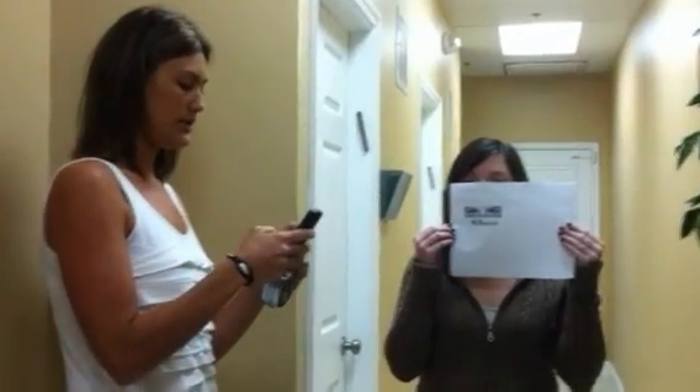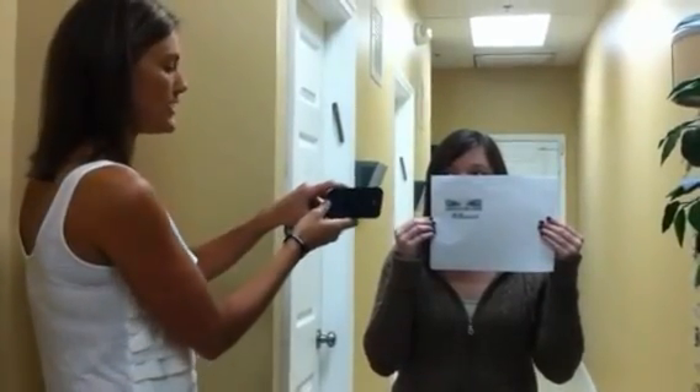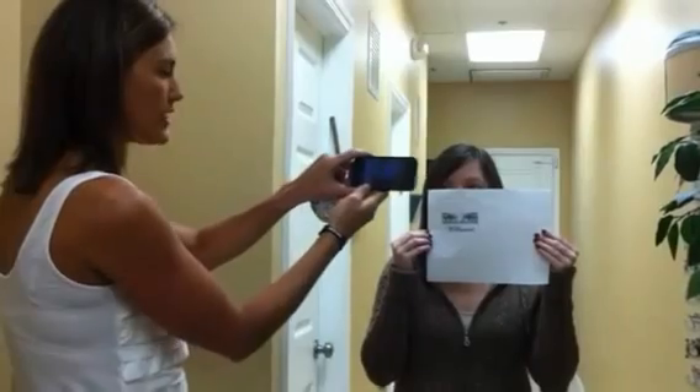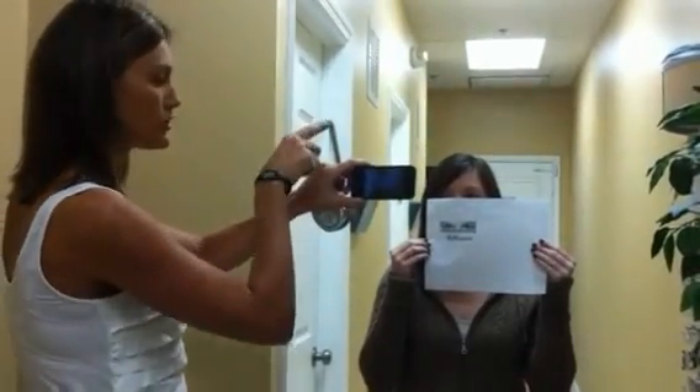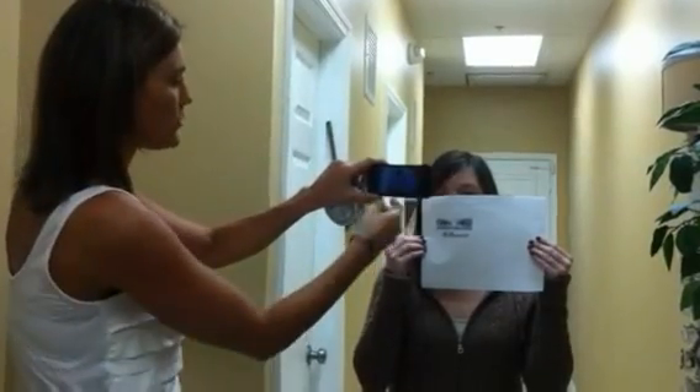So Kathleen has this file that we will send you via email and she is going to hold it up right under her eyes. Put it up as high as possible, just underneath the pupil — perfect. Now, what I am going to do is take a picture. I want to take the picture next to her because I want Kathleen to make sure she looks straight ahead all the way out there. I don't want her to look at the camera and I don't want her to look at me.